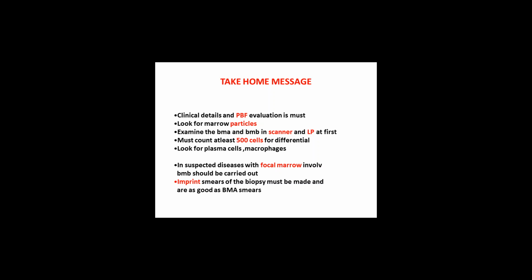That is a bit traumatic for the patient. Although I accept it's easy for us. We can do quick in, quick out from the sternum. It hardly takes less than 5 minutes, and the sample yield is wonderful.